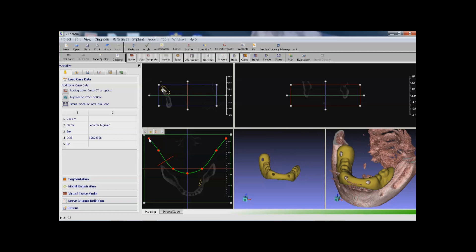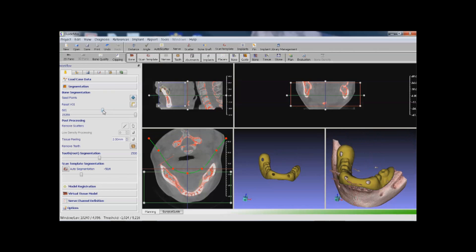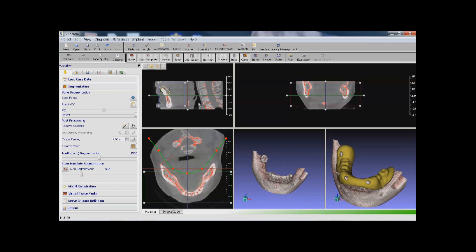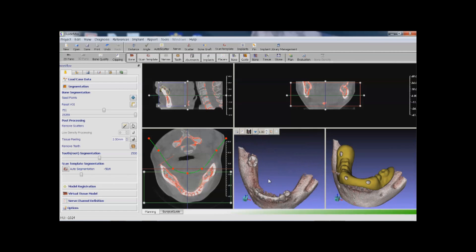Next, we want to segment the bone structure. We adjust the region of interest, the thresholds, and add a seed point. For this case, we also want to perform an automatic scatter removal — all we need to do is click on this button. We also have a manual tool to remove scatters.